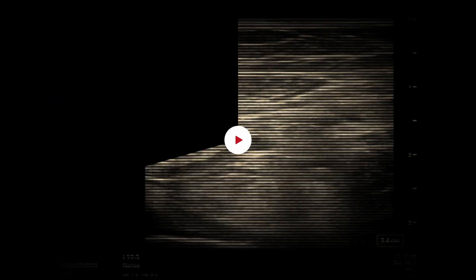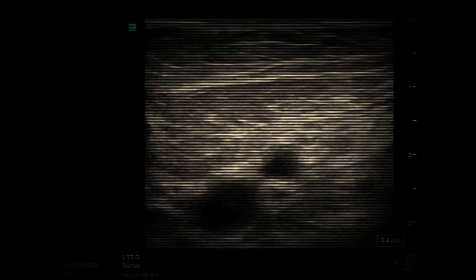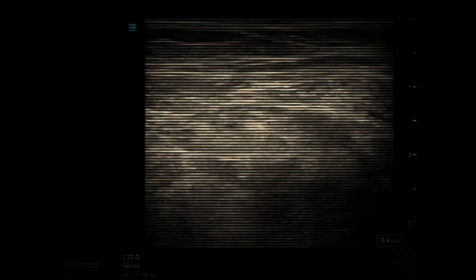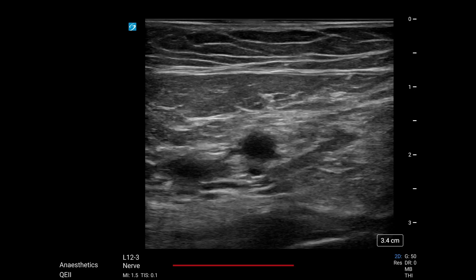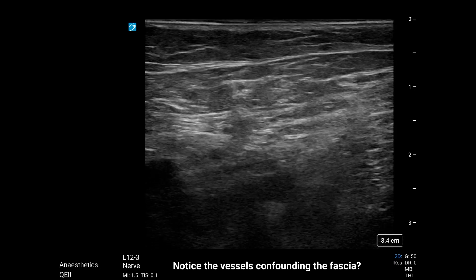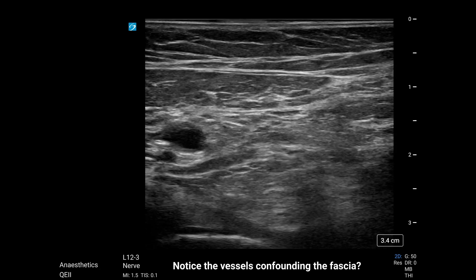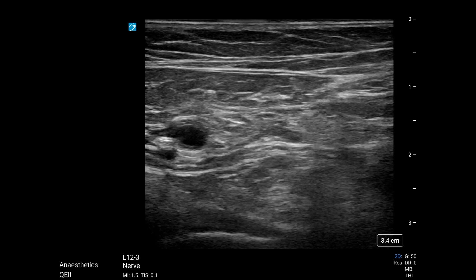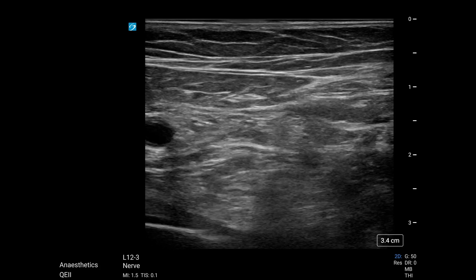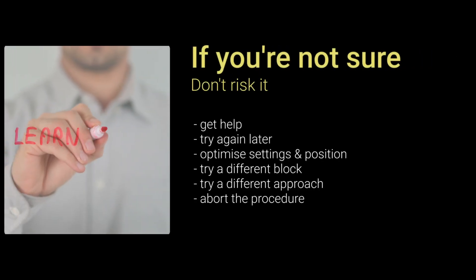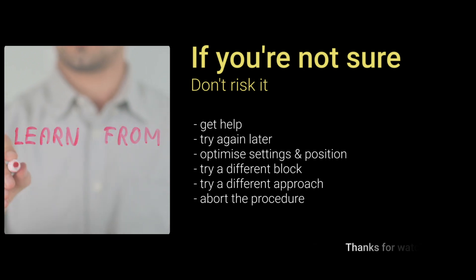The true fascia iliaca at that point was far more superficial. It's worth going back and reviewing the early pre-scanning footage at the start of this video, knowing what you know now. If you find yourself in a situation where you're about to do a block and you're not sure of the anatomy, with all those pressures on you, the only wrong option is to crack on and risk a nerve injury. If you haven't found the nerve and a safe path to it, then you have options. You can abort the procedure, bring the patient back another time, get a second pair of eyes for another opinion, or change to a different block or a different approach.